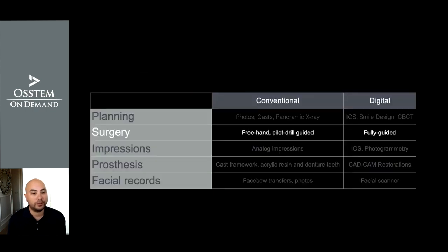Let's now move on to the surgery. Conventionally, we place the implant freehand or with a pilot drill guide, and with the digital innovation, we now have fully guided protocols that I'll be discussing later.